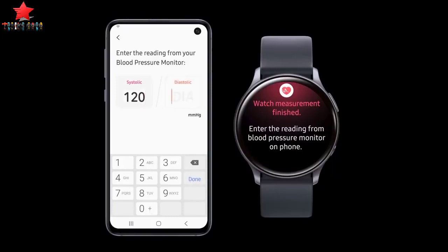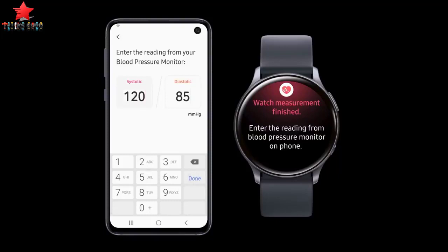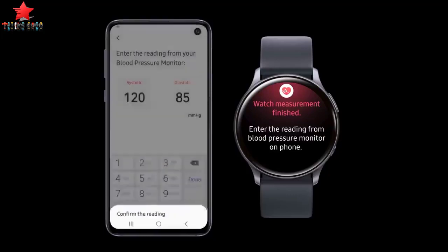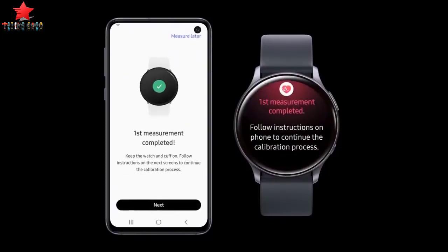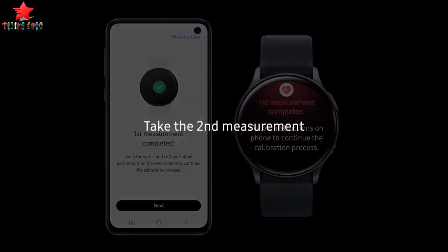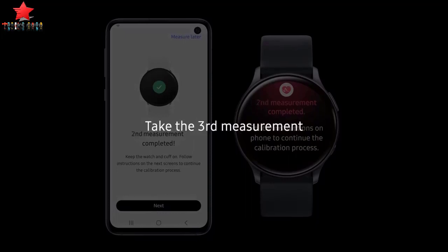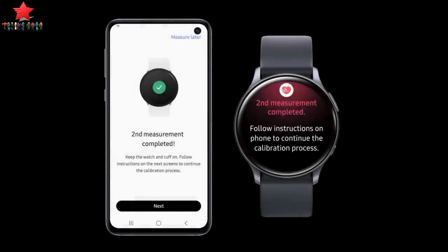This is one of many examples of how Samsung is integrating its best-in-class hardware with the latest software innovations to innovate mobile experiences. Once your Galaxy Watch Active 2 device has been calibrated with a traditional cuff, you can simply tap to measure your blood pressure any time, anywhere. The device measures blood pressure through pulse wave analysis, tracked with the heart rate monitoring sensors.